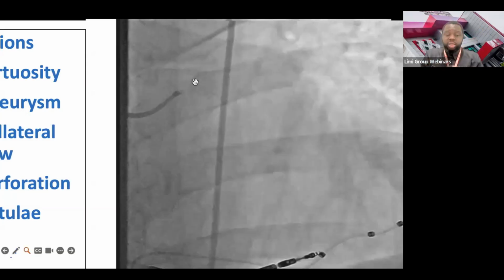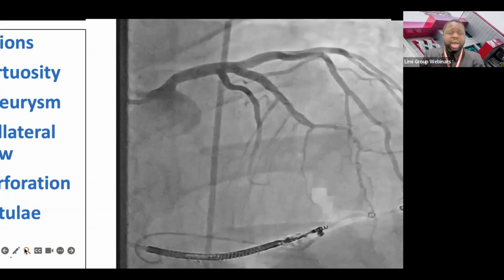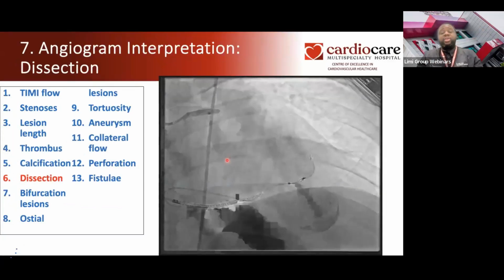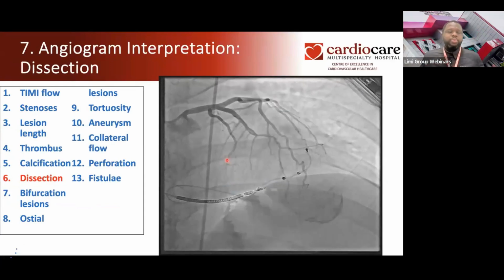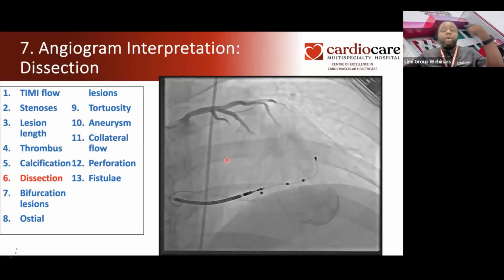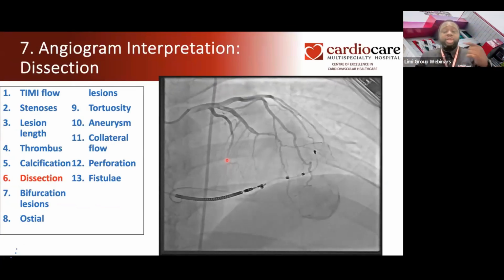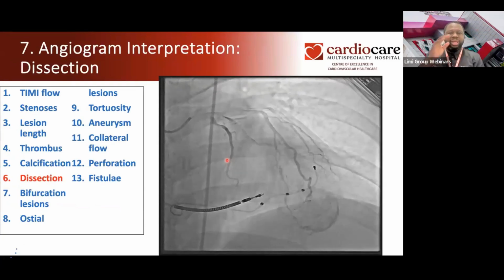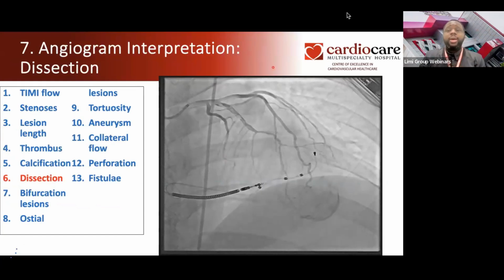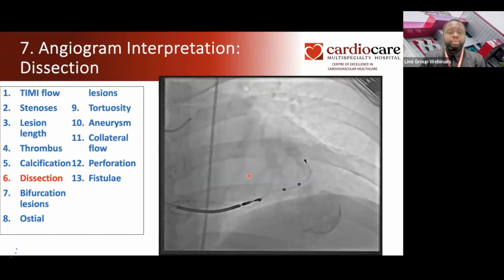So when we see this, you typically have to act. But in SCAD, the studies have shown that if there is good anterograde flow, leave it alone. Don't be tempted. If you try and put in a stent, more dissections will keep on happening. So in SCAD particularly, spontaneous coronary artery dissection, stenting is not typically done in that regard. All right.